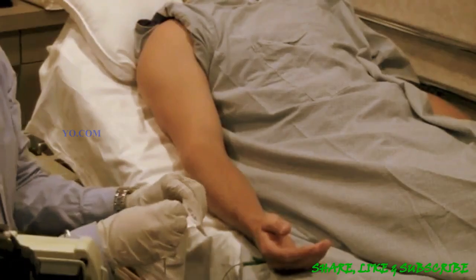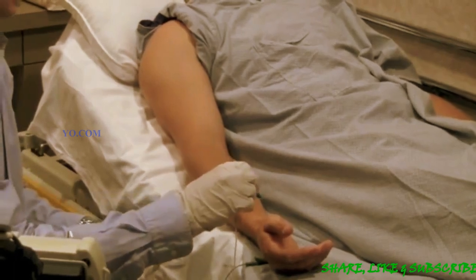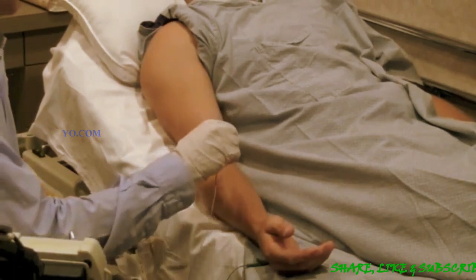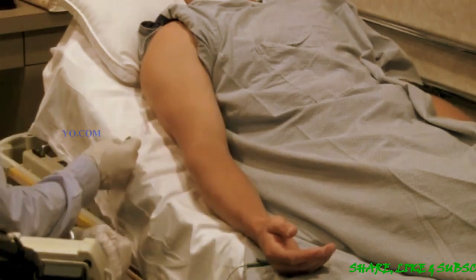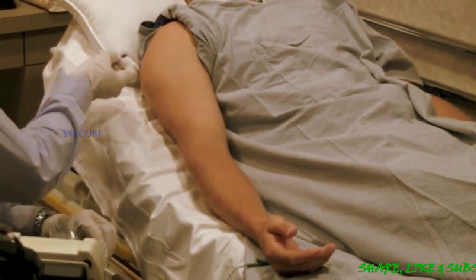For this study, there's not a lot of preparation. We just ask that you don't put any lotions or oils on your arms or legs. An EMG is an electromyograph. The EMG is performed by the physician. He takes a small needle and places it in several muscles in either your arm or leg. This can be a little uncomfortable, but it is tolerable.